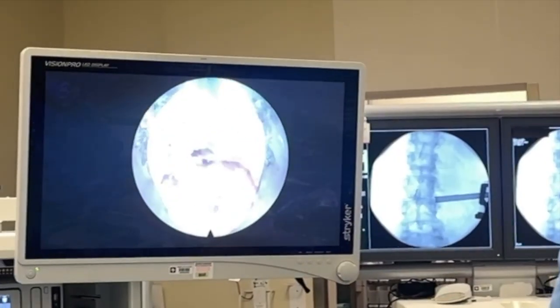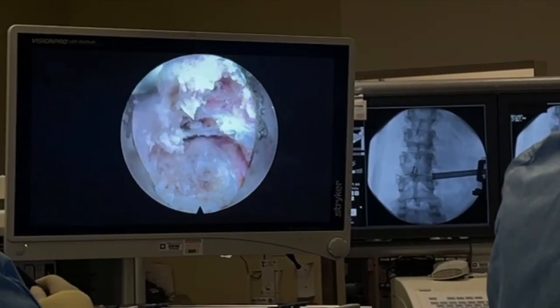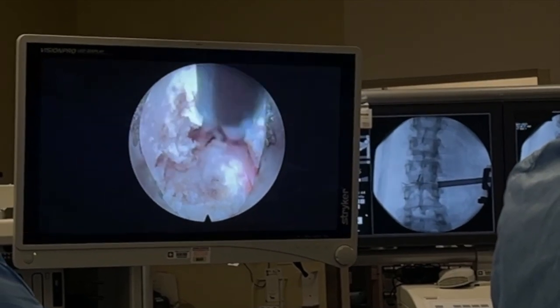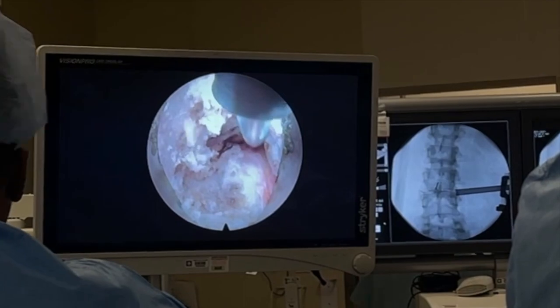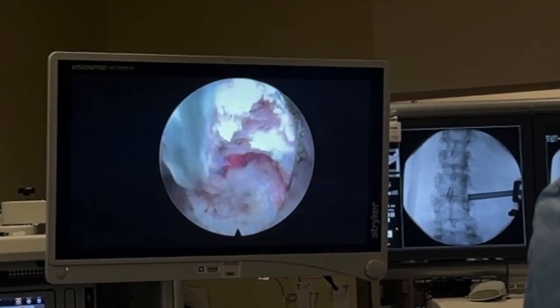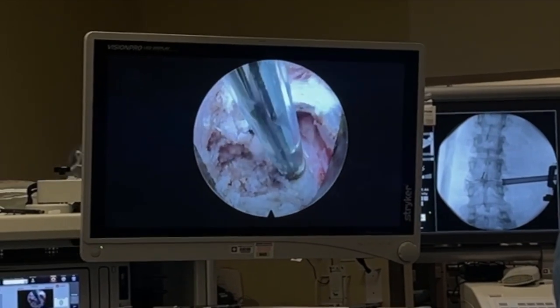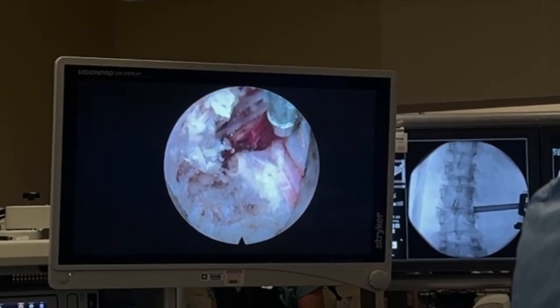Shot. Alrighty, this is the 3-4 level right here. Here's the neuroforamen. The canal is in here. You can see this big bump right there. It's not big, but it's clearly a bump. I've been slowly releasing all the adhesions from the arthritis. I'm gonna go in here and look for some trapped fragments and restart the healing process. There's the exiting nerve root right there, look away.